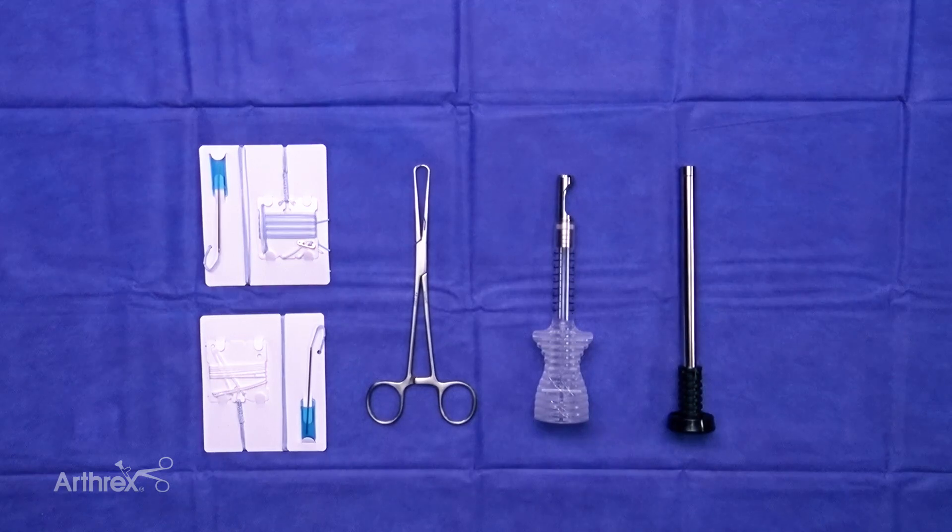Hi, my name is Dr. Jason Skopp and I'm the director of the Joint Preservation Center at Tidewater Orthopedics in Salisbury, Maryland. I'm excited to present the Quad Pro Tendon Harvester, which is an update on our current quad harvest technique, showing how we can integrate both a soft tissue or a bone quad tendon graft using the same device, along with fixation using the fiber tag tightrope.